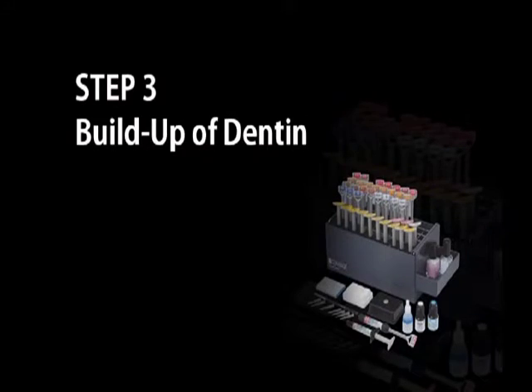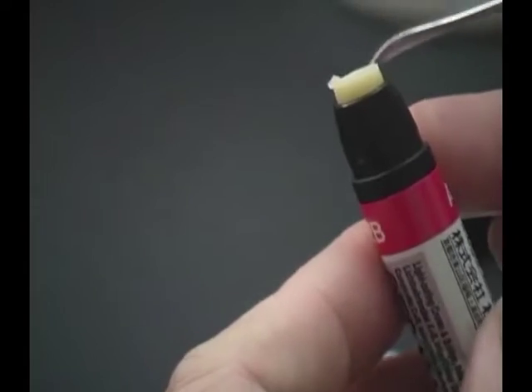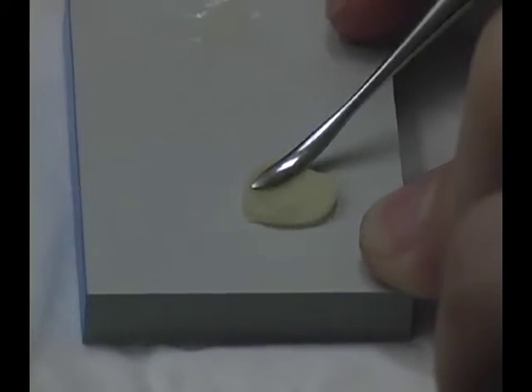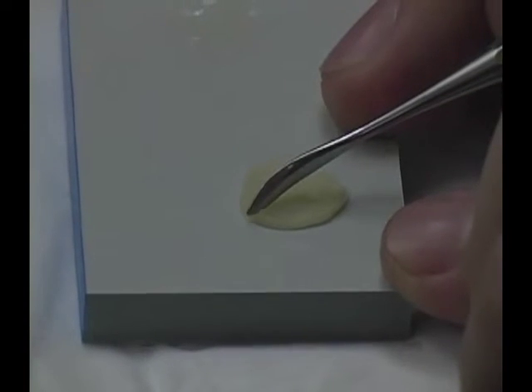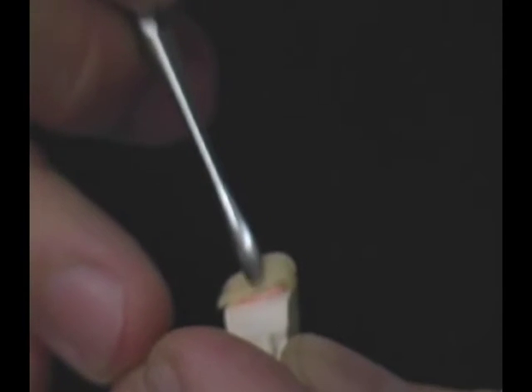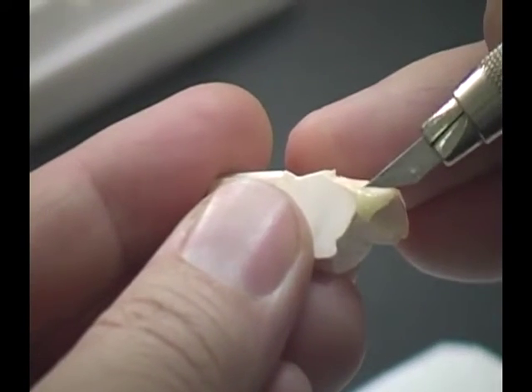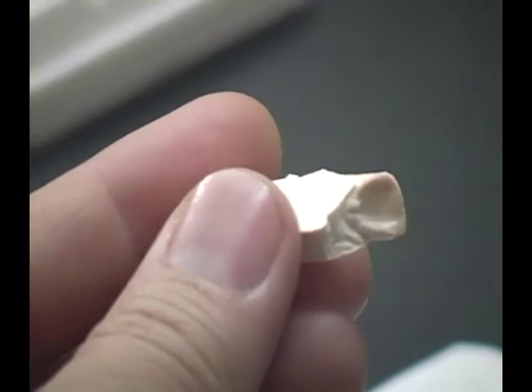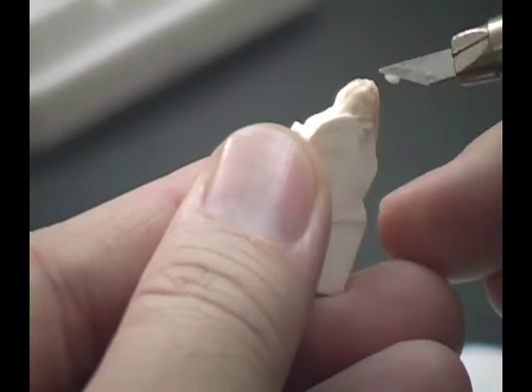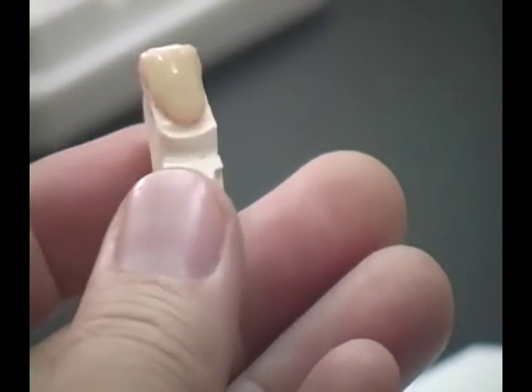Build-up of dentin. Select the desired shade of Ceramatch body. Dispense the required amount onto the paper pad and spatulate it for easy application. Then pick up half and adapt on the die, pressing gently to avoid air bubbles. For veneers, the opaque layer is not required unless when masking discoloration. Remove the excess from the margin area with the cutting knife. The first application is complete.